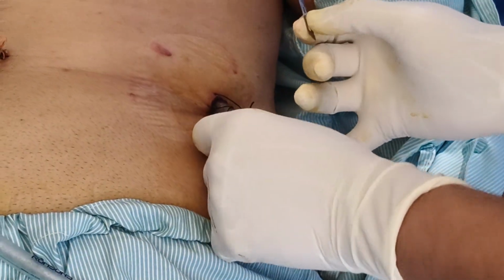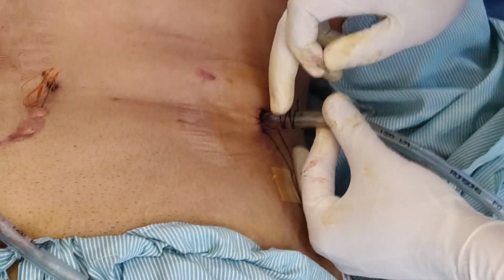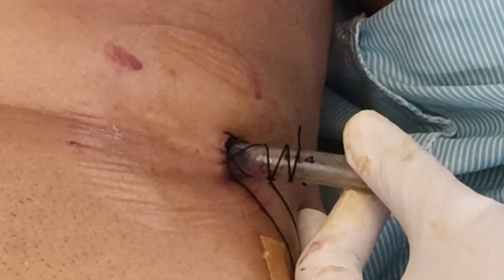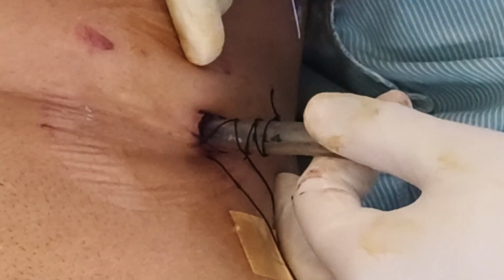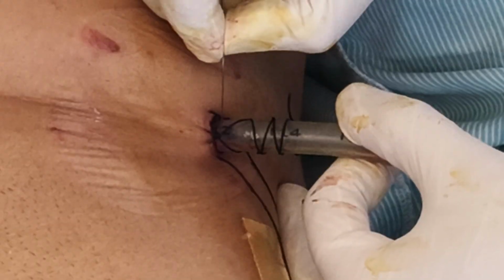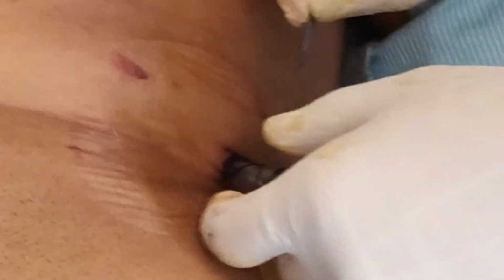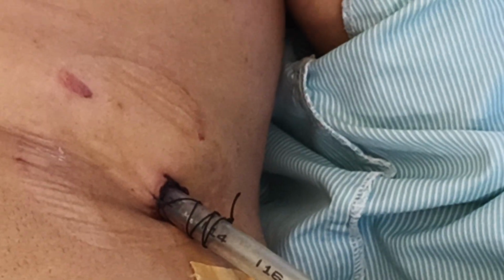Superficial. Okay. Local. Now see, once you see the drain, here you can see that this drain is hitched to the skin. It is put in first in the OT, and this drain is attached to the skin, so that even if I pull it out or push it back, it won't go. So you have to disconnect that. You have to find the point where it has been hitched. Okay, here it is. Once you disconnect it at this point, the drain will be free to move. It can come out also, it can go in also.